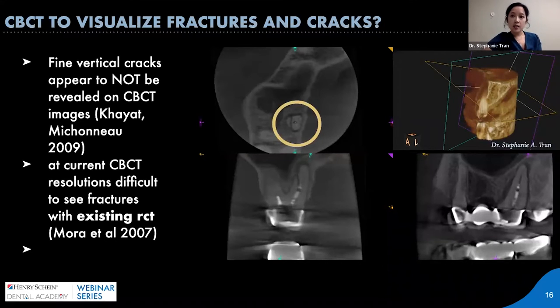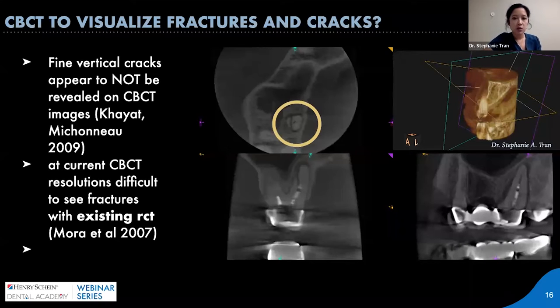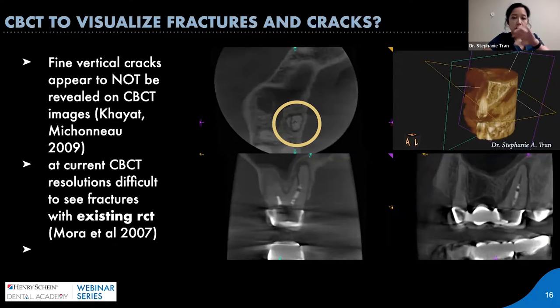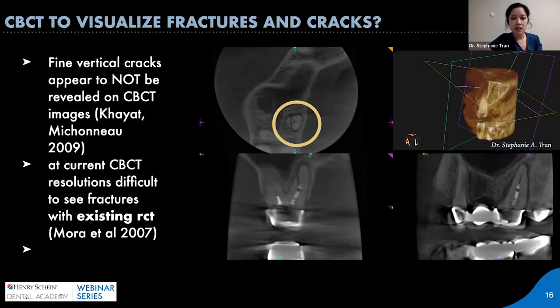Does 3D radiography always see fractures better? Unfortunately not. One reason is that beam hardening phenomenon. Another is that very tiny hairline fractures are often not revealed on CT, as we've seen in multiple instances of literature. The existing root canal filling materials can also sometimes block out, or beam hardening can cover up where the fracture is. Sometimes we can see it very clearly, but it's not always the case — just because you have a CT scan doesn't mean it will automatically show every single crack and fracture.